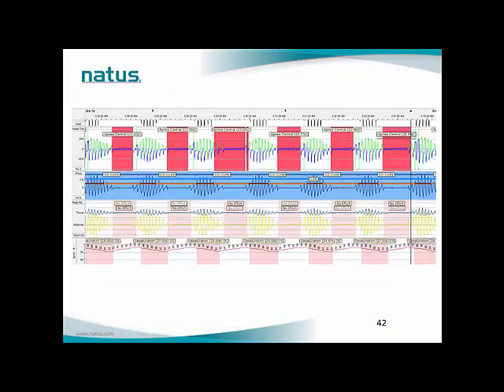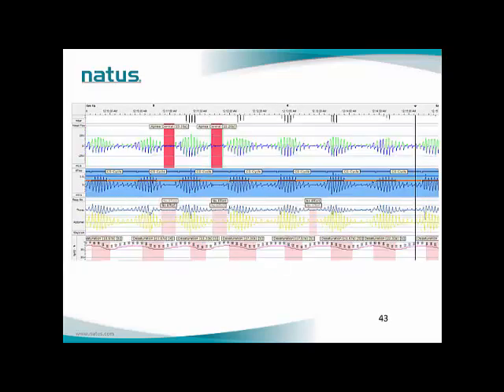In this example, we have more than 3 central apneas with a crescendo-decrescendo pattern, and the automatic module was able to detect the CSB parameters on the X-flow as predefined. In this example, there are more central hypopneas, and the module was able to detect the CSB parameters on the X-flow as predefined.